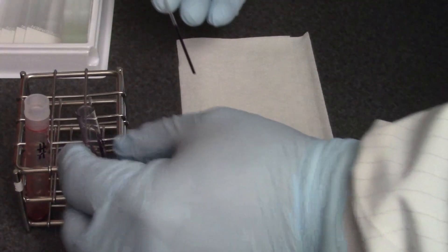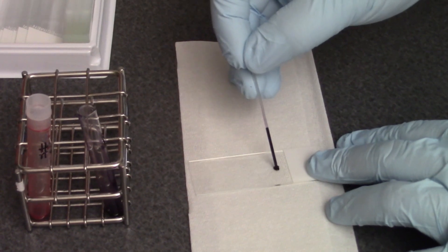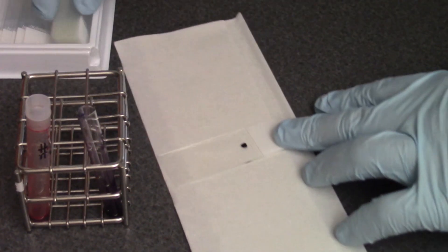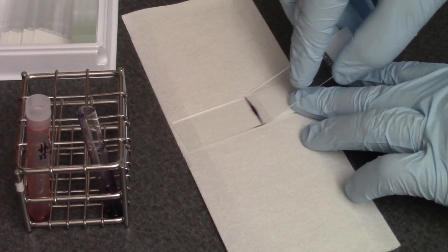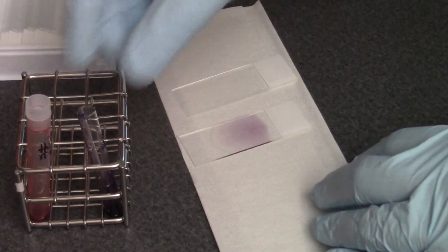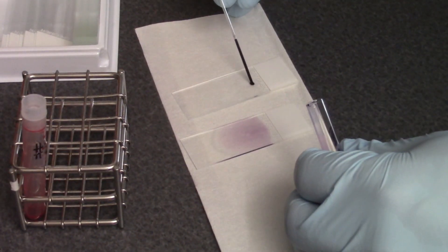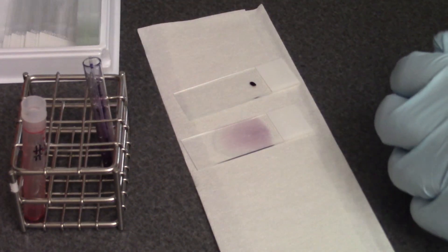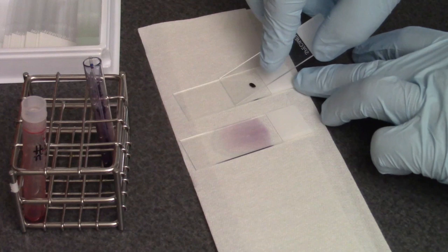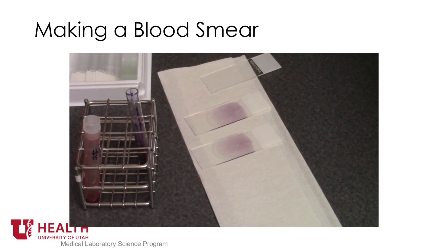After the 10 minute incubation, prepare three slides using the wedge pull film technique. Label the slides with the appropriate patient information and allow the slides to air dry.